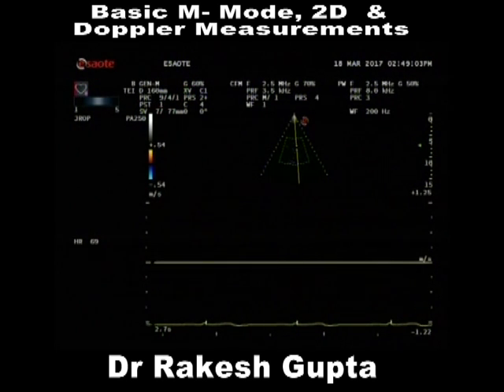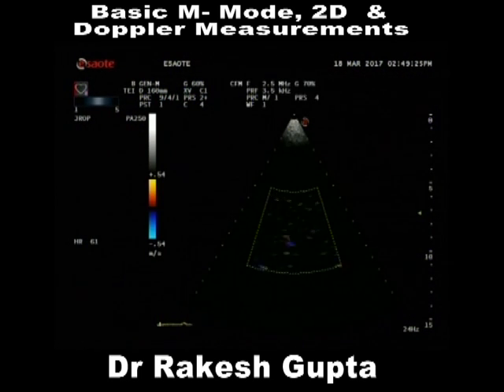And this is the reason why we want to keep the sector volume of color as small as possible, because every point is utilizing energy. Pulse Doppler utilizes energy at this point only, but color utilizes energy in the whole of this box. So the frame rate dramatically drops down. Another important issue: you switch on this color, look at the frame rate, it drops down to 24.